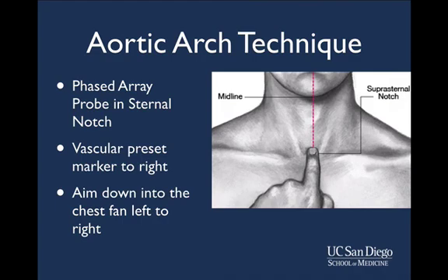The technique to see this involves using the sternal notch as your acoustic window. We will use a phased array probe and put the preset to a vascular mark. We will aim down into the chest and fan very slowly left to right.